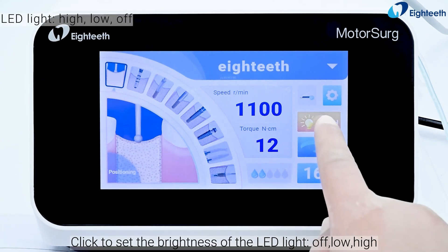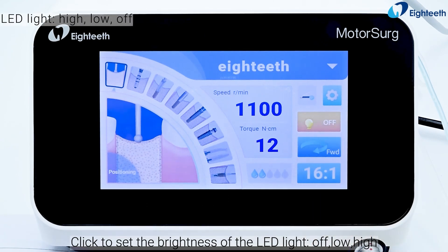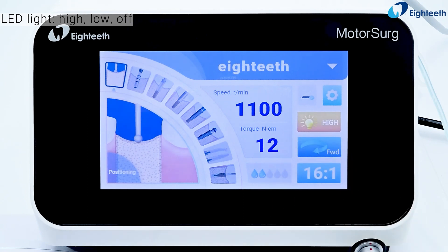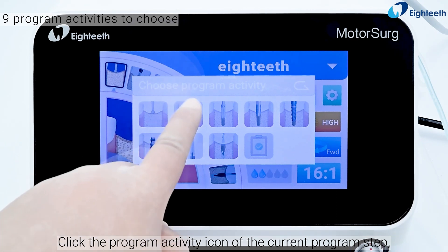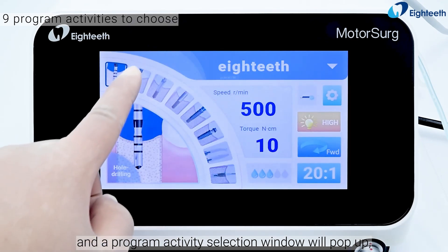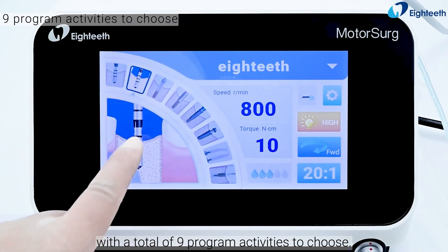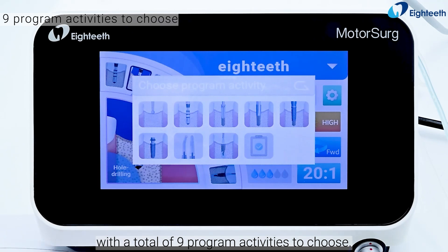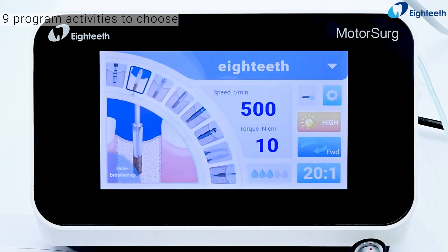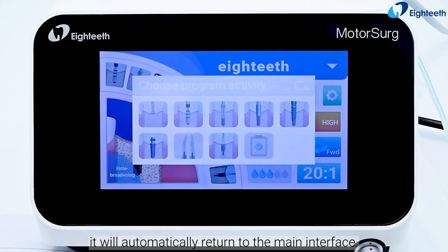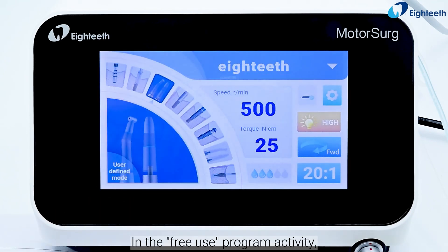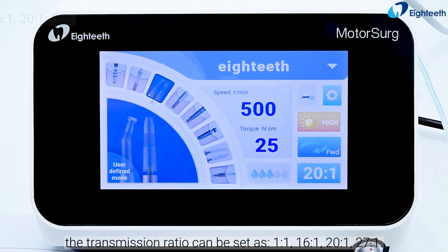Click to set the brightness of the LED light: off, low, or high. Click the program activity icon of the current program step and a program activity selection window will pop up, with a total of nine program activities to choose from. After setting the program activity, it will automatically return to the main interface.